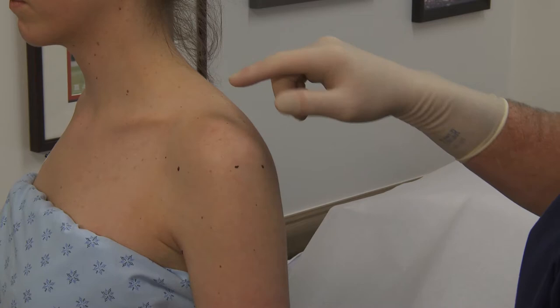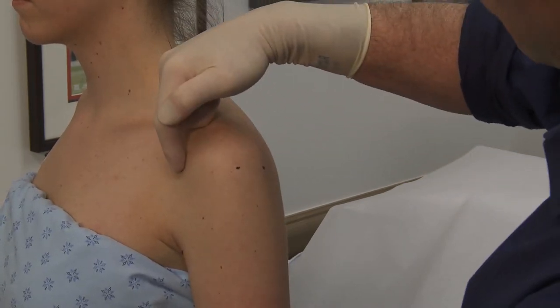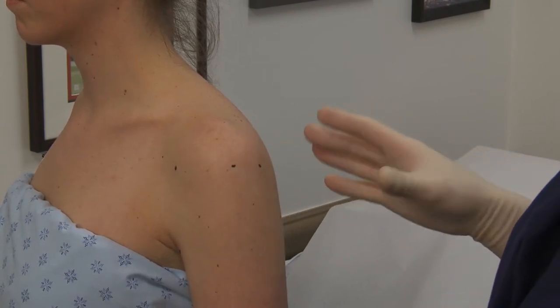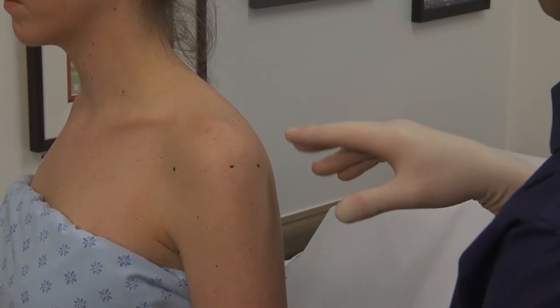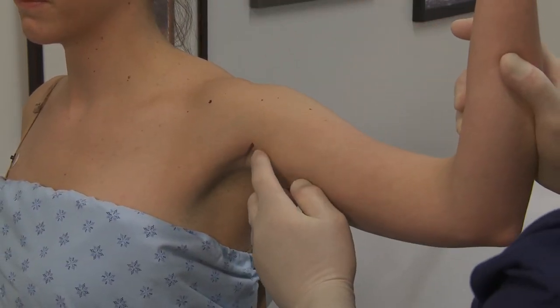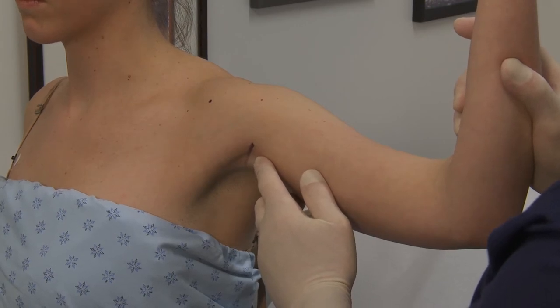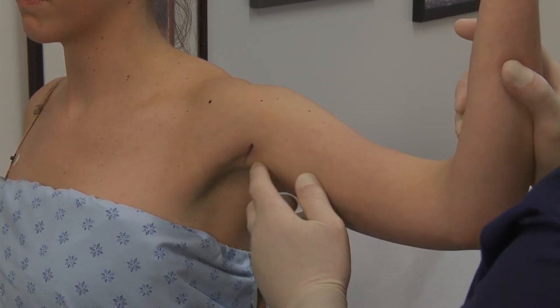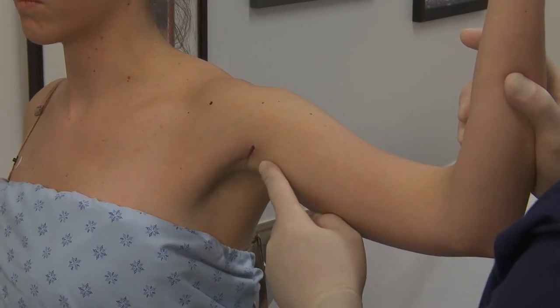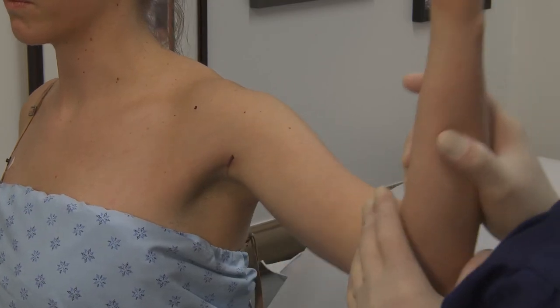If you have undergone arthroscopic shoulder surgery, you will have a series of small portals. There will be one in the front, two on the side, and one in the back. There may be a variation of these portal placements. If you undergo bicep tenodesis, you will have a small incision in your axilla. This incision, as well as your portals, will be closed interoperatively with dissolvable sutures. However, the axilla suture will need to be trimmed at two weeks post-op.